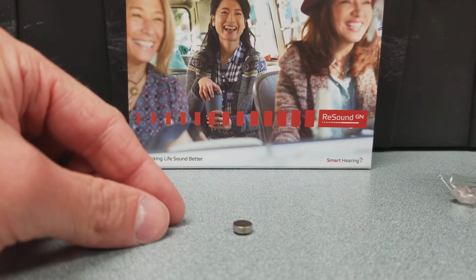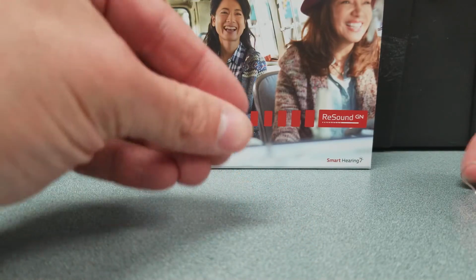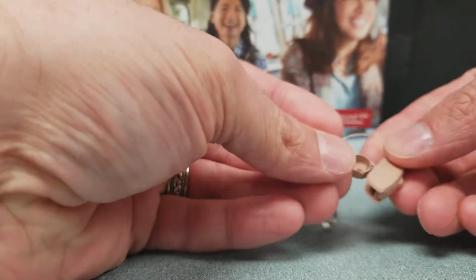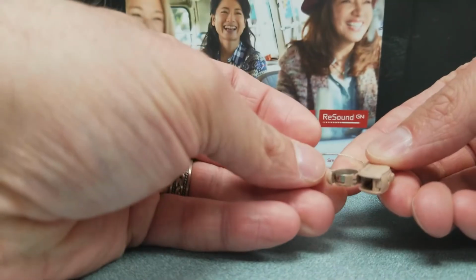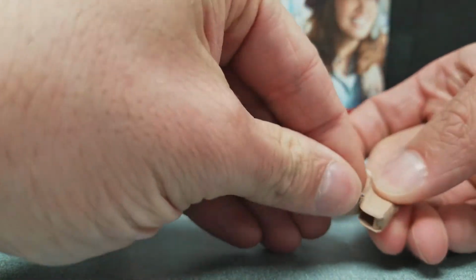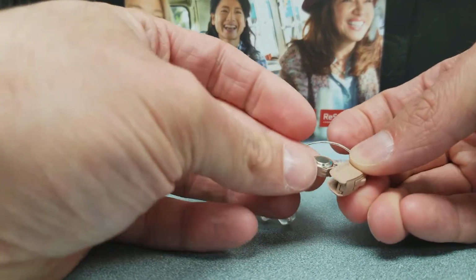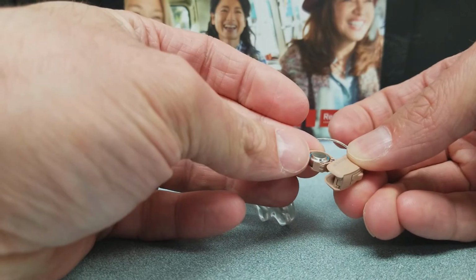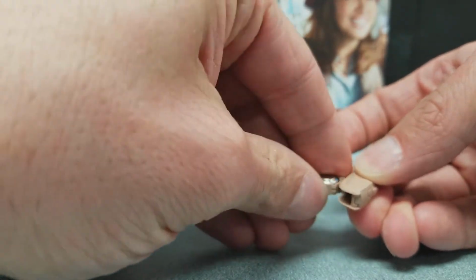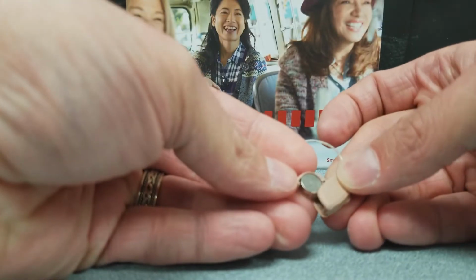To put the hearing aid battery back into the hearing aid, you just want to make sure that this ringed blue side goes towards the bottom of this bowl, just like so. The top should be completely flat and flush. And then you can close it and it will turn on. If you do it improperly, if you put it in upside down, you're going to see that blue ring, which is an automatic no, and then you notice it can't close. Alright, so we're going to remedy that. You're going to take it out, ring side down, flat side up, which happens to be the positive as well, and then close it up.